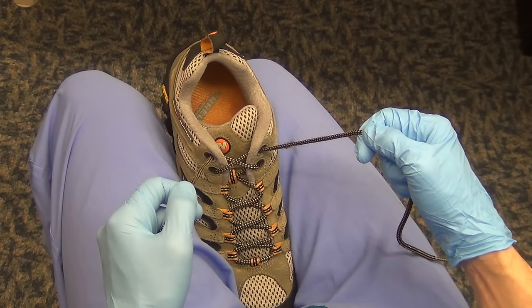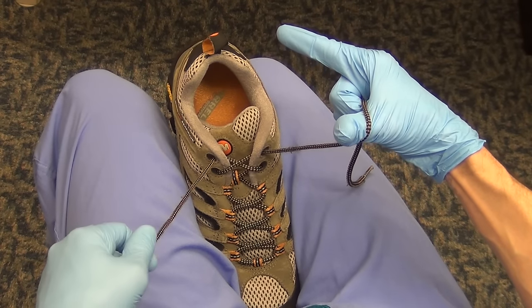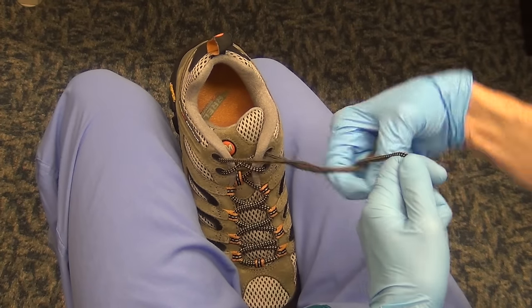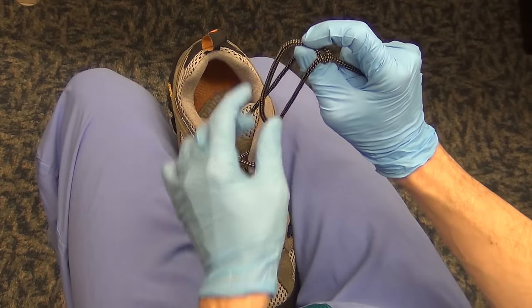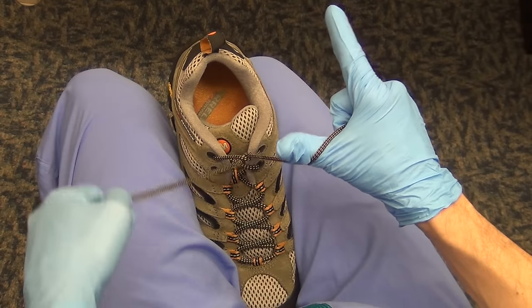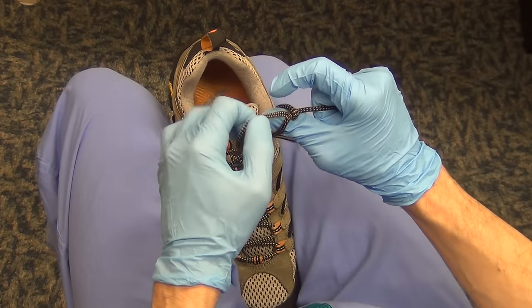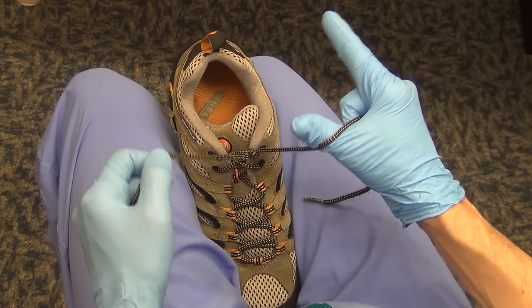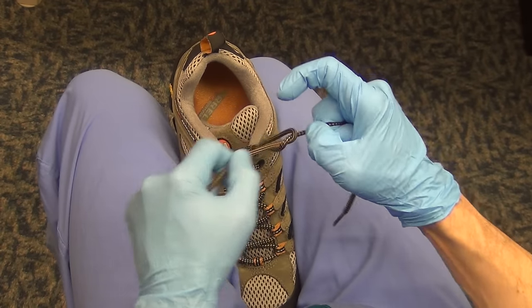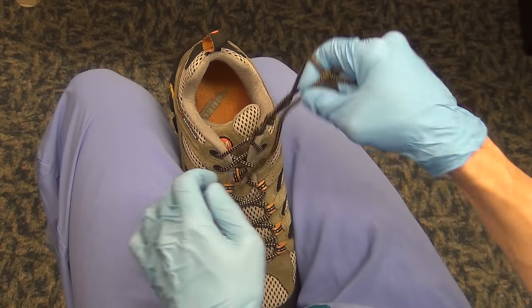Now we're going to work on the thumb side. Start with shooting guns, and whereas the index finger was an internal rotation, you're going to externally rotate with your thumb. Create half the suture circle, bring the other loop around to create the whole suture circle, then close your index finger and thumb. Push your index finger through, grab the tail, pinch it between your fingers, push that tail through the suture circle and put it down. Repeat: external rotation, suture circle around your thumb, close your index finger and thumb, push your index finger through, pinch the tail, push it back through the loop and down.